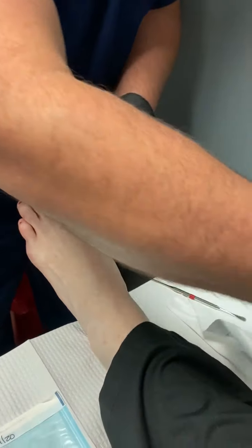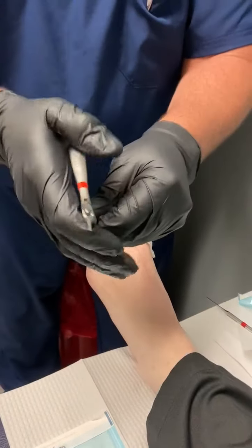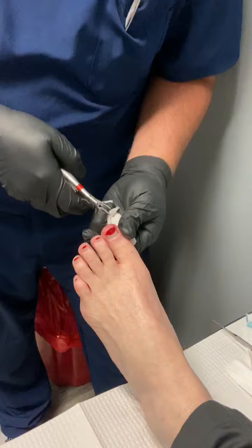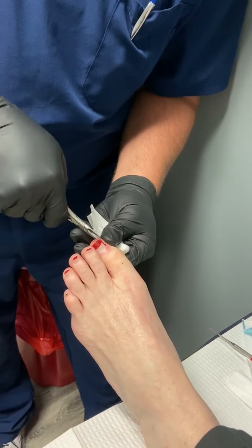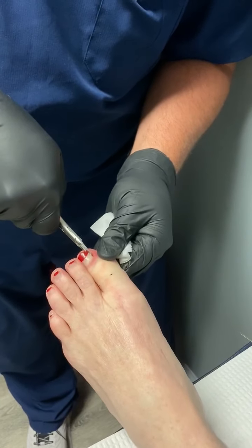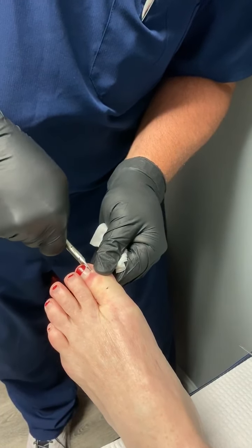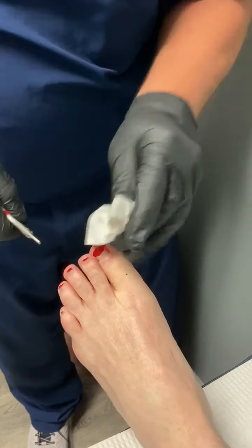That's step one. Step two — this is called an English anvil, flat side down. Clip, slide it under the skin. Both sides.